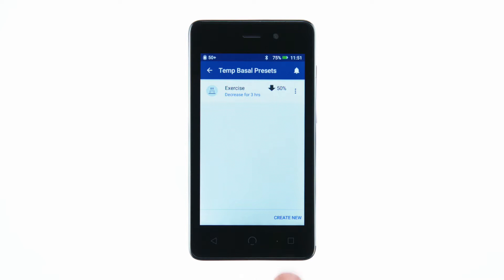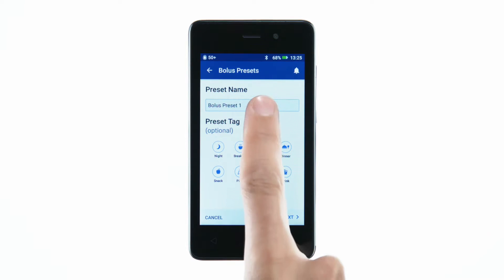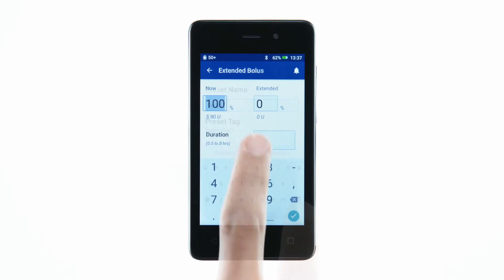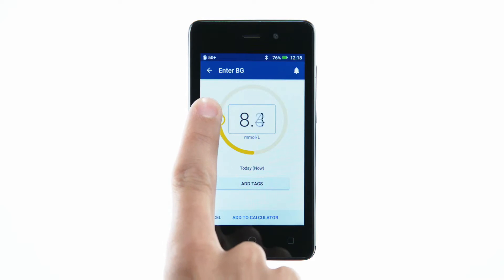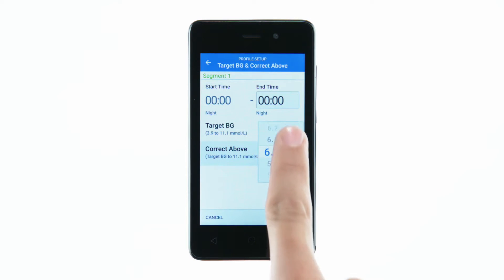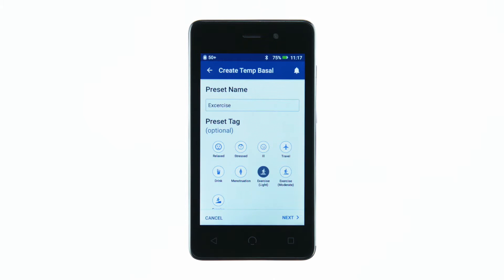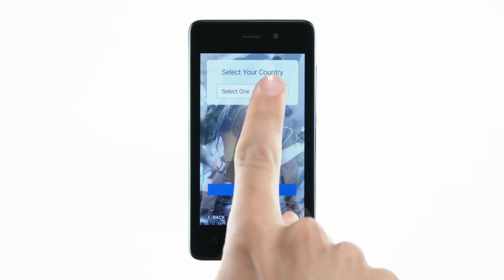Fields that you can edit are either underlined or framed by a box. To edit them, tap the field. This opens a keyboard, number pad, slider, or scroll wheel. While using the PDM, you will also encounter toggles, checkboxes, radio buttons, and drop-down lists.